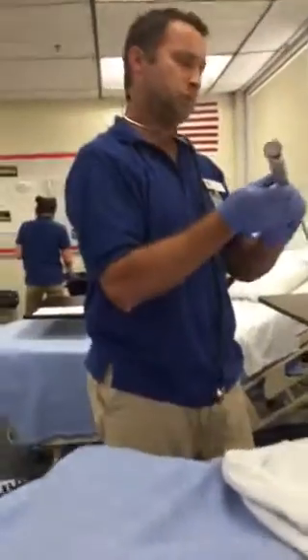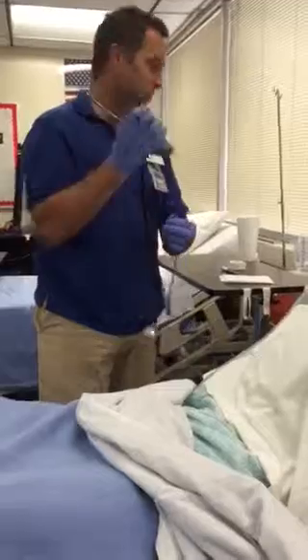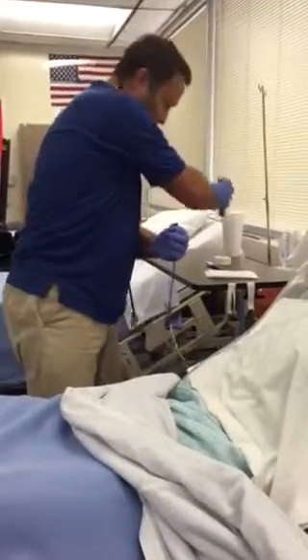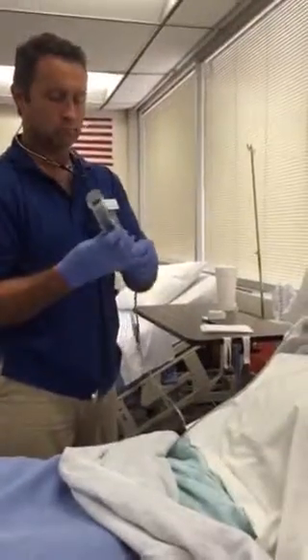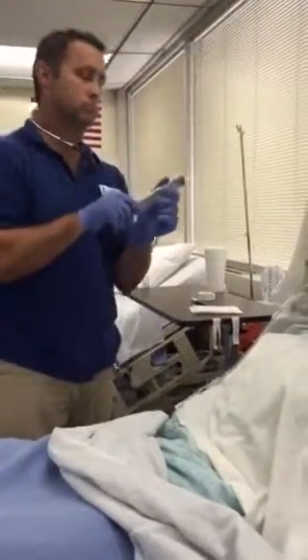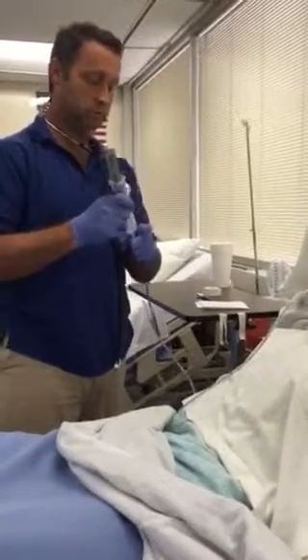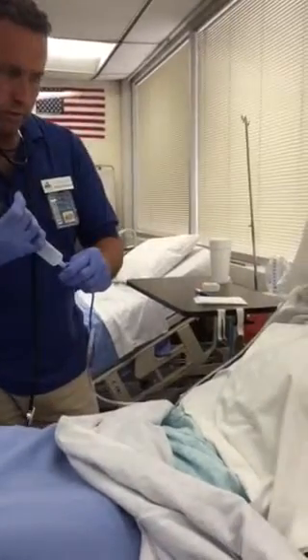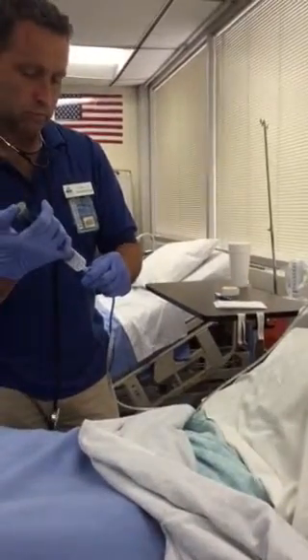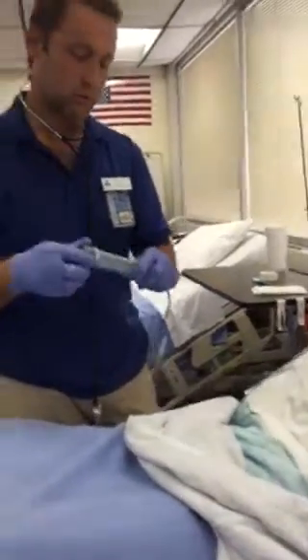Okay. Now at this point, disconnect. We want to suck up 30 milliliters of saline or water. I'm going to suck up just normal water. All right. Sucked up 30 milliliters of water. And then we will introduce it. Okay, and we introduced 30 milliliters successfully, no issues.